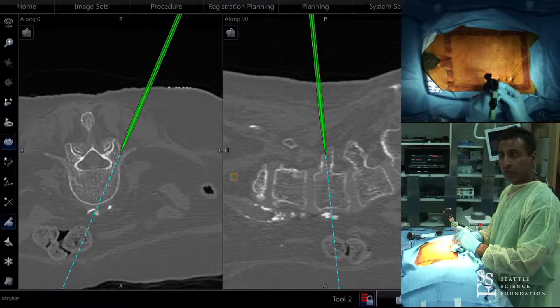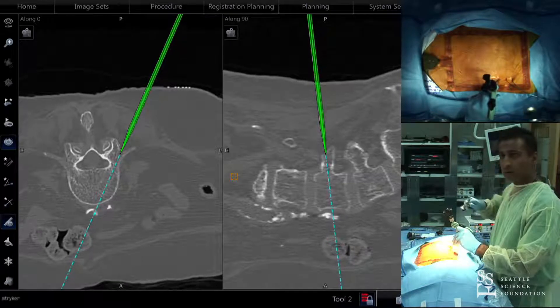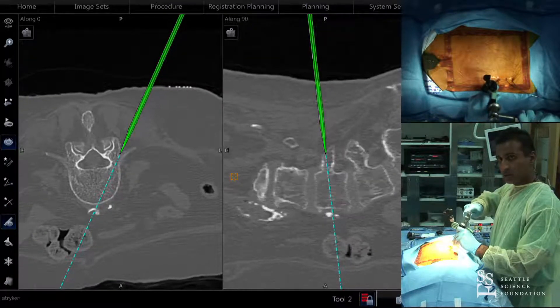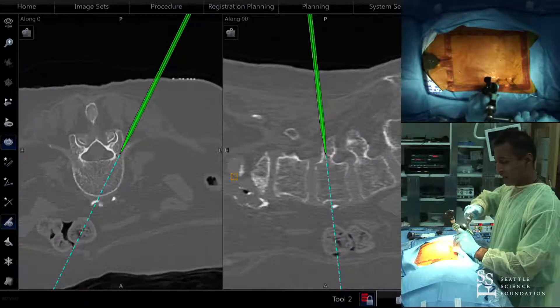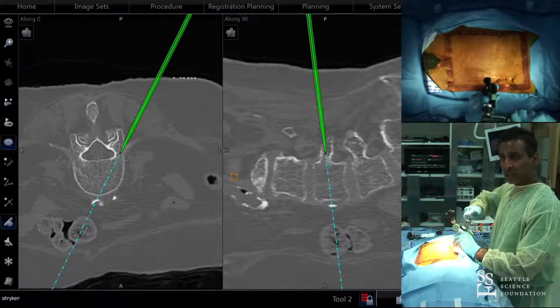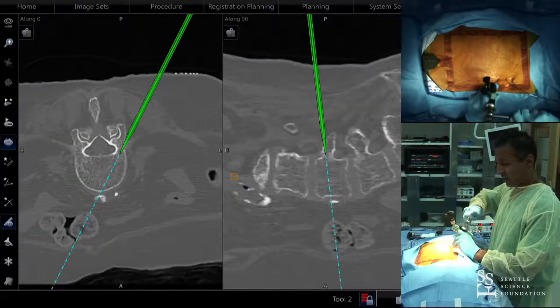That looks pretty good for L4. The nice thing is I'm not having to wear any lead or radiate my hands or eyes.